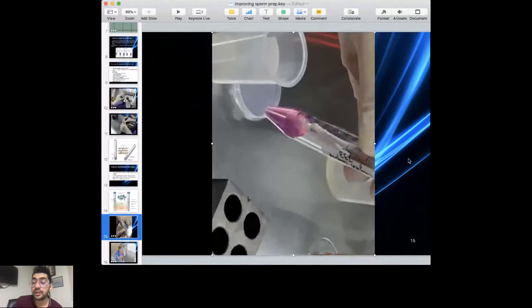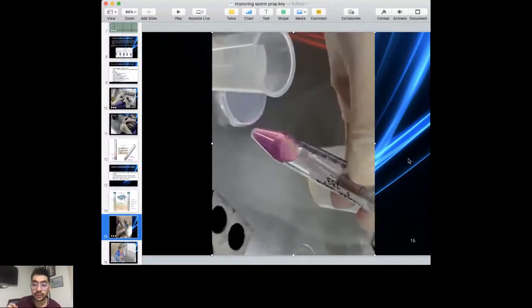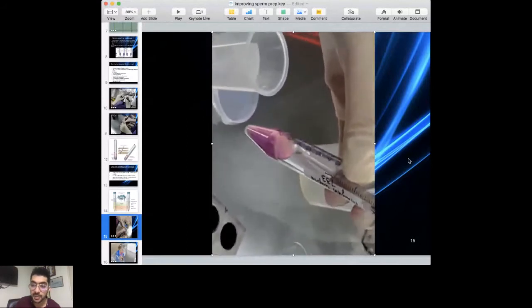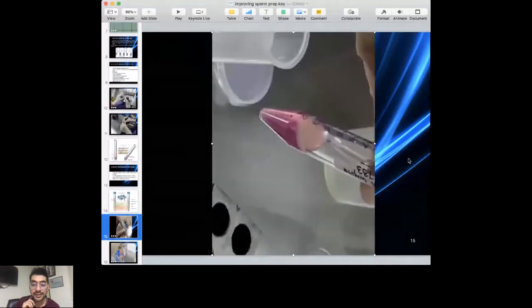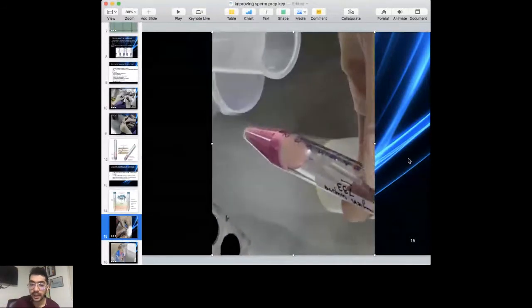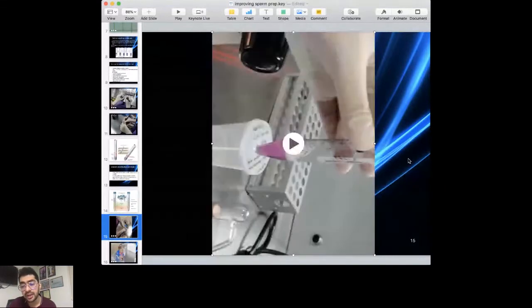Now, this is a tricky question in the sense that when you're using a density gradient, what you have to understand is the size of the sperm and the size of the RBC are somewhat similar, but the RBC is a little larger as compared to the sperm. So in some scenarios, you might get separation, but it will not be the clearest, right? So you might still have certain RBCs which will come into the pellet just because the size and densities would not compensate for separating out the RBC.